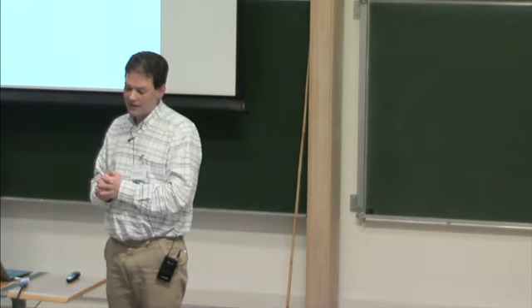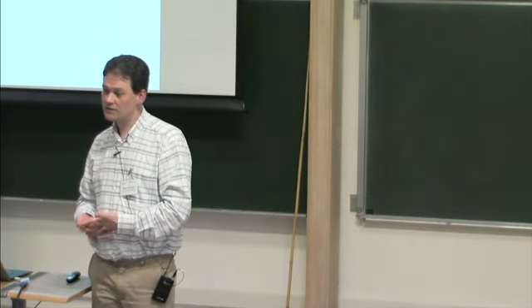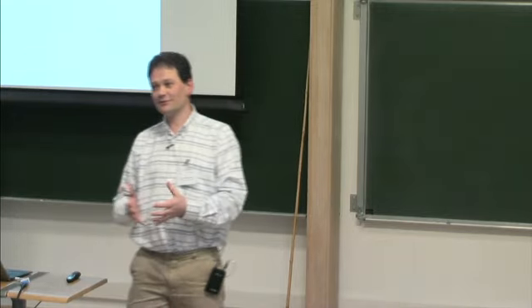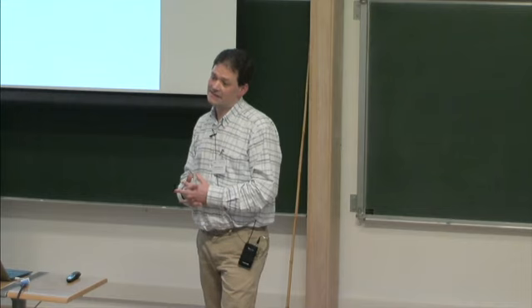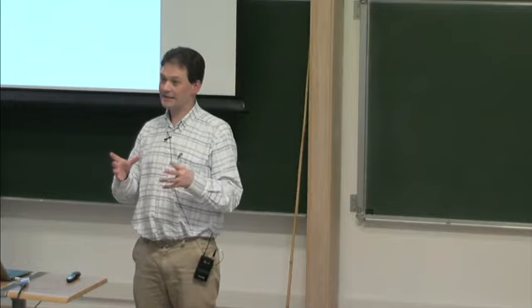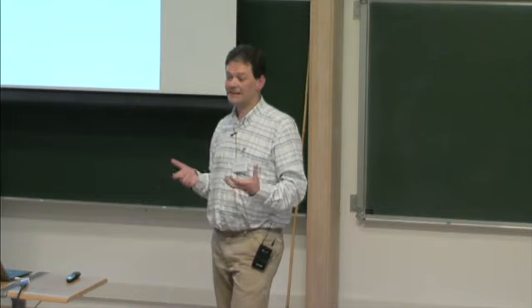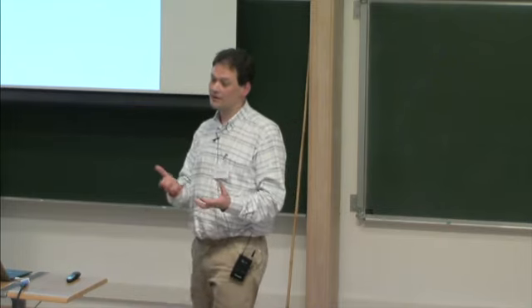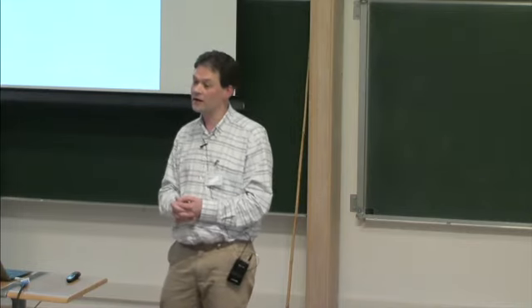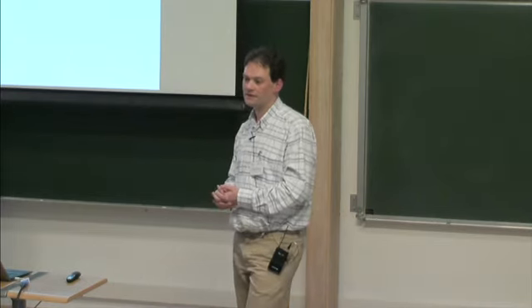Another area, without thinking about the selective excitation, might be surface coils as well. So clearly with particularly medical systems rather than ours, you can have 256 separate channels, and so you're recording data which itself has lots of locally selective spatial information already encoded in it, without actually worrying about those selective excitations.